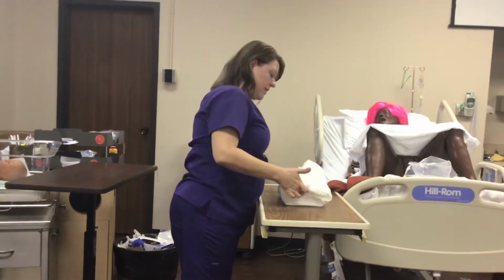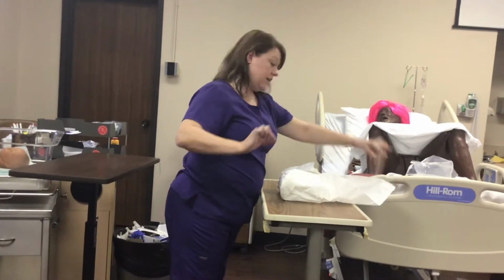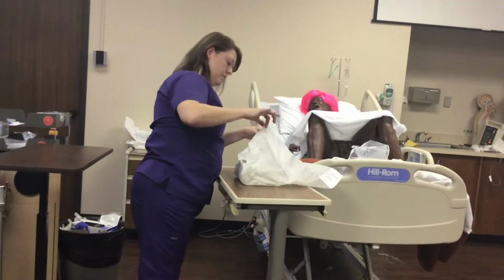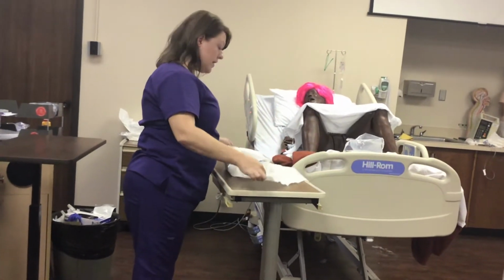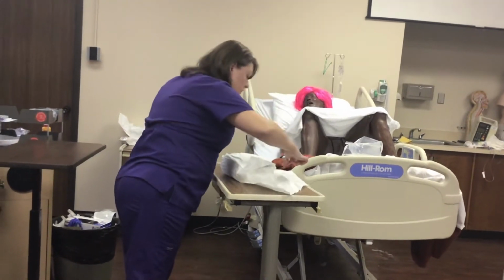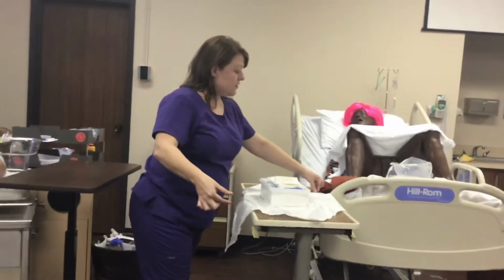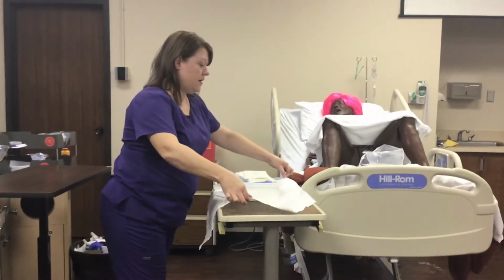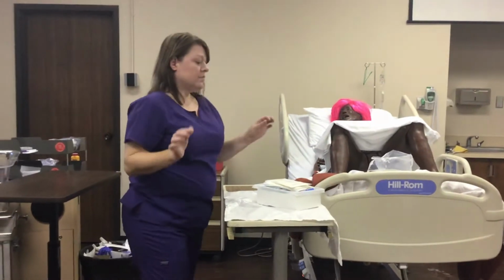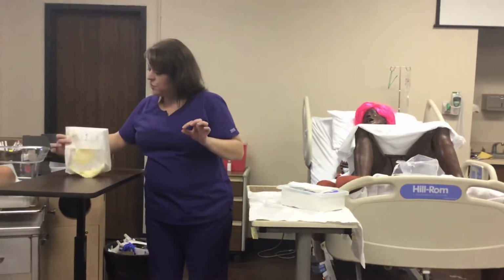To the outside of the package. Outside, making sure that I keep my fingers on the outside margin. I did outside, inside. Now I'm going to do this one. And then again, keeping my fingers on the very tip, I'm going to slide that there. I'm going to place my surgical gloves over here just so I have more of a workspace.